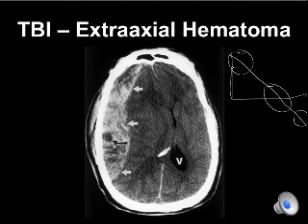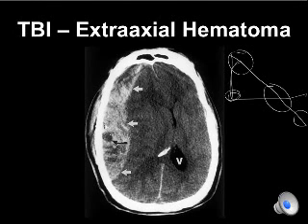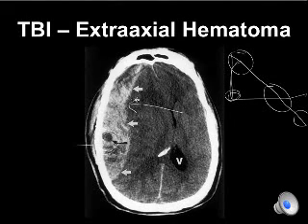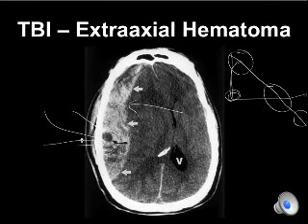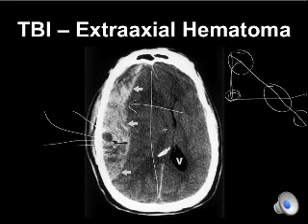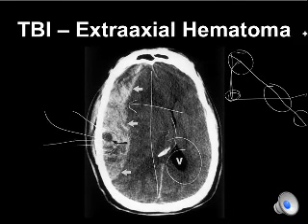There's one exception to that rule. In the very acute phase, the blood can also be hypodense. So when you see a pattern where you have some areas that are relatively hyperdense and some other areas which are hypodense, you shouldn't be falsely reassured thinking you're dealing with something acute and chronic. You should think that the hypodense area is actually hyperacute — meaning this hematoma is actively bleeding and you can expect it to grow in size. There's already significant mass effect, midline shift, and ventricular compression. This sign is called the Swirl sign.